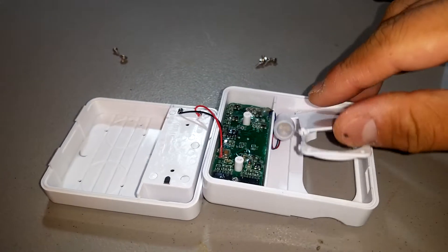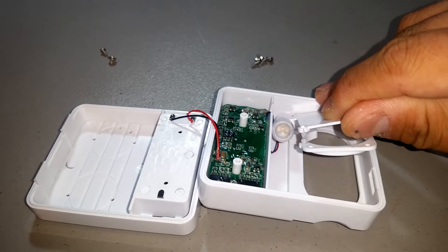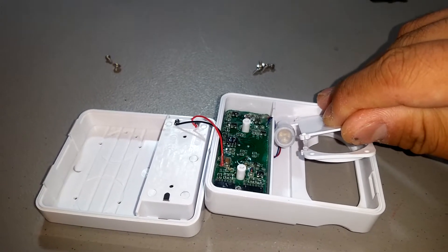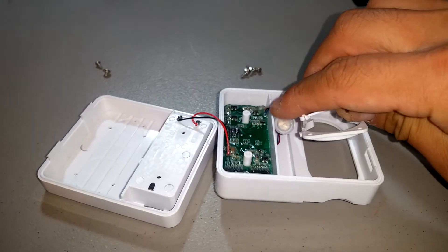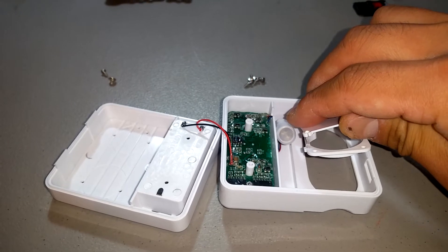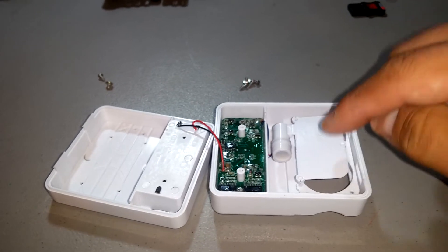This thing right here has basically a vibrating motor that you would see in your phone. It's basically an unbalanced weight that rotates, and because it's unbalanced, it vibrates this.